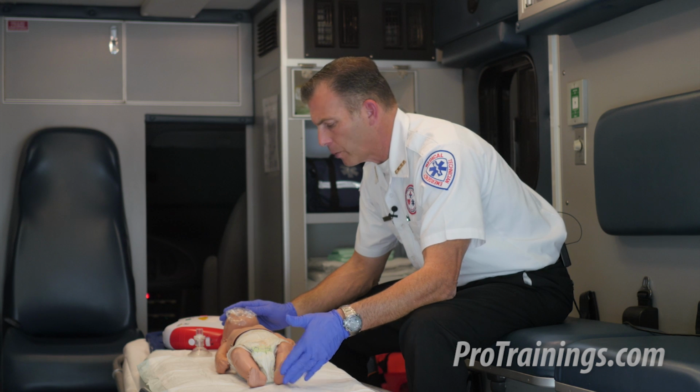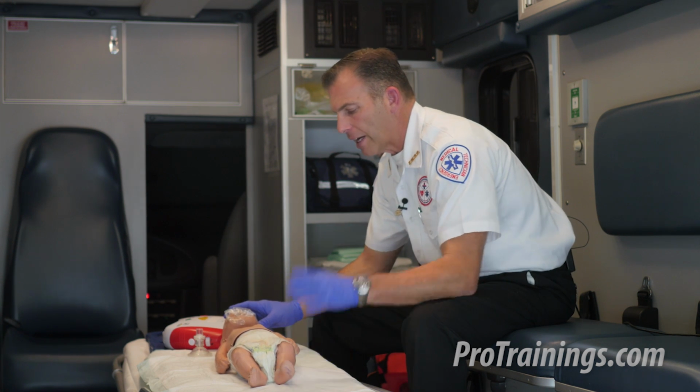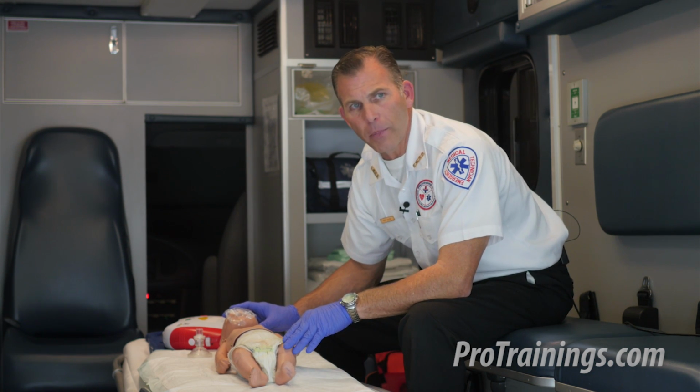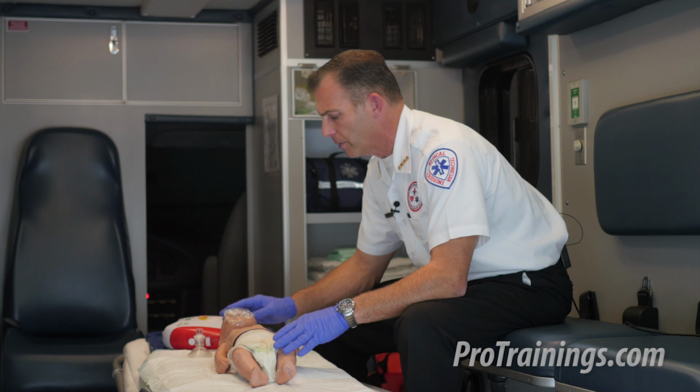I tap and shout on the baby, "Are you all right? Are you okay?" They don't respond. I activate EMS by calling 911 or calling a code. You in the plaid shirt, go call 911 and come back. If you see an AED, bring it with you. But in this case, I already have one, so that's not needed.